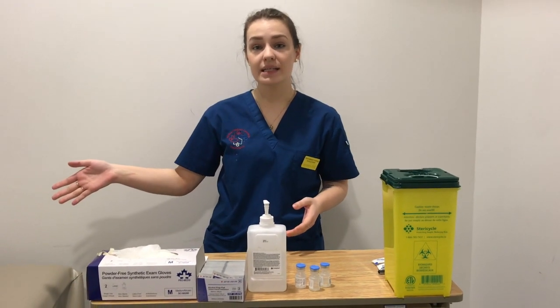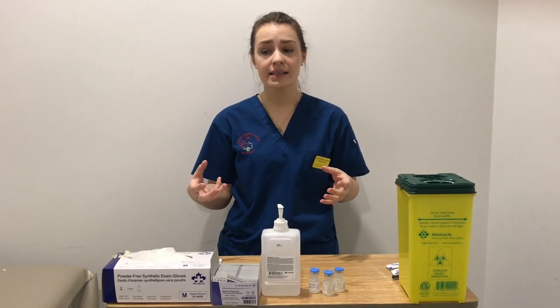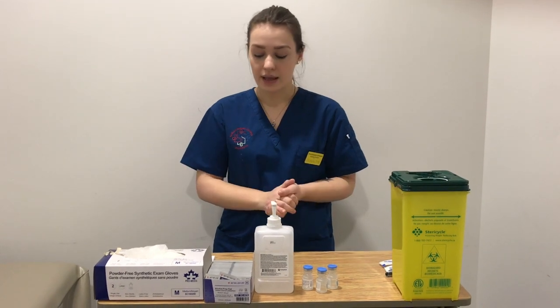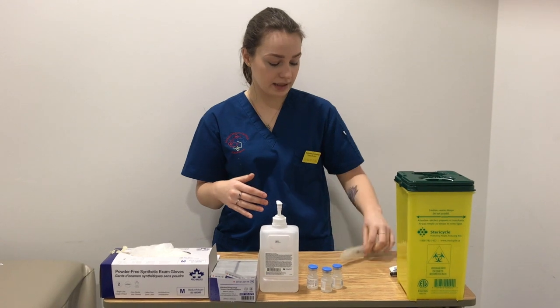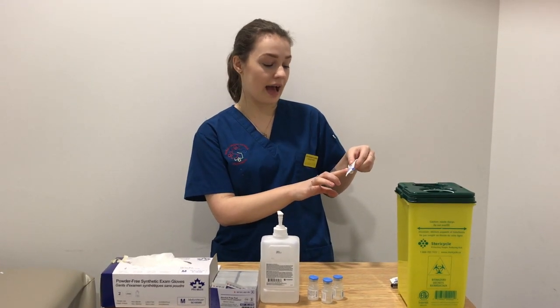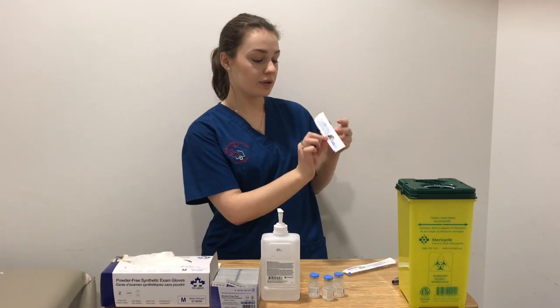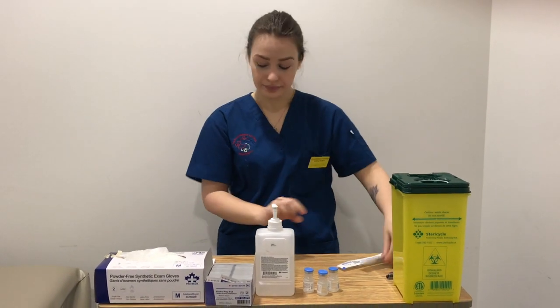So now we're going to be choosing our needle sizes. So based off of Mr. Mancini's structure, his body build, the amount of tissue and fat he has, as well as the fact that he is a male, so he's a little bit more heavy built than a female would be, we're going to be choosing our 2 needle sizes. So for subcutaneous needle injections, I have chosen a 27 gauge needle with a 1/2 inch needle length. And then for our intramuscular, we're doing a 22 gauge needle with an 1.5 inch needle length.